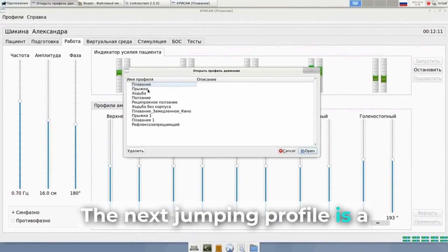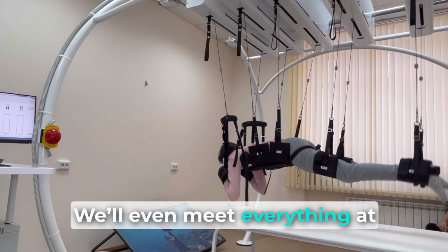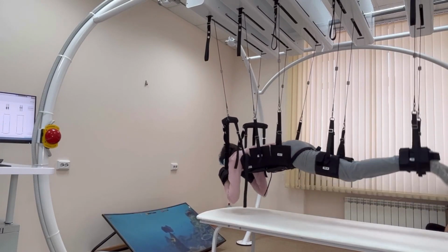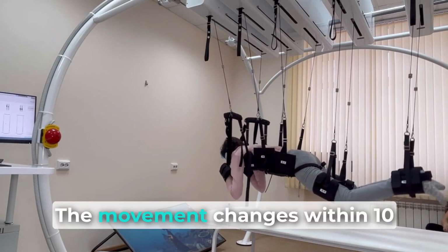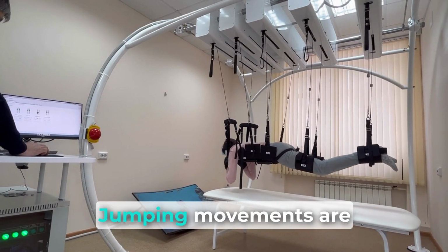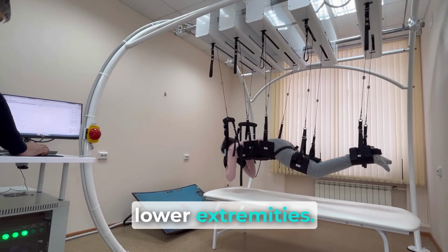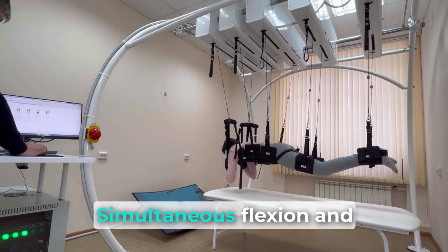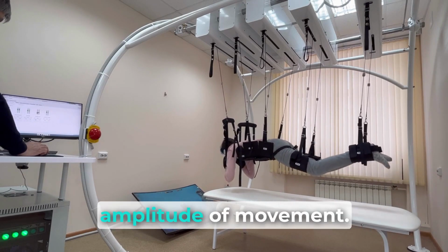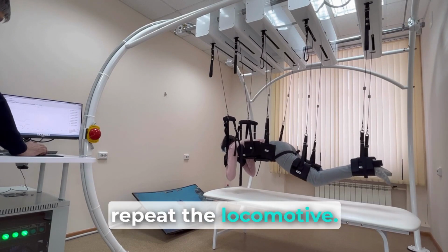The next jumping profile is a fairly simple profile that many children can repeat. We can use it at every level on the GMFCS scale. The movement changes within 10 seconds after applying the new settings. Jumping movements are characterized by joint work of the large muscles of the lower extremities. Simultaneous flexion and extension of the hip and knee joints. We also gradually increase the amplitude of movement. We recommend that the patient repeat the locomotion.